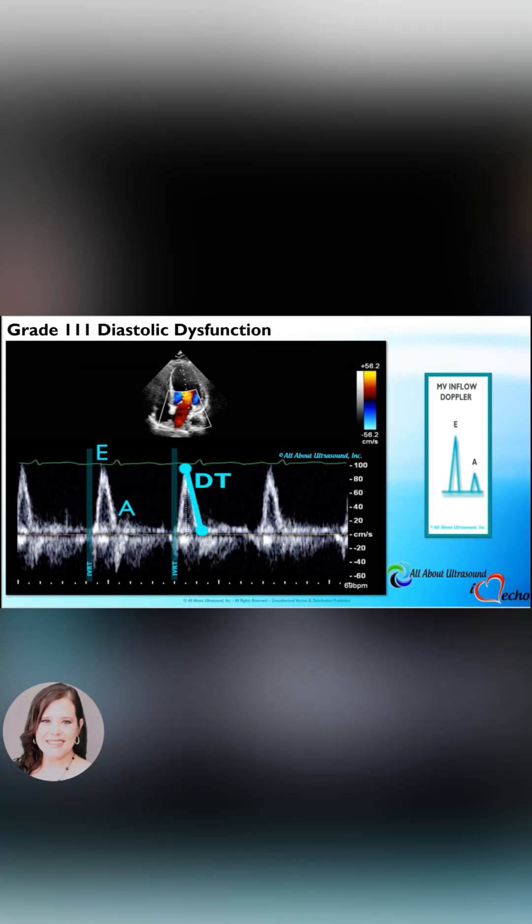Young patients or patients with athletic hearts may also show similar waveform patterns. Evaluate for the patient's ejection fraction as well.